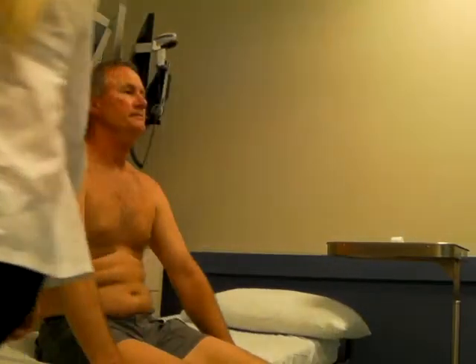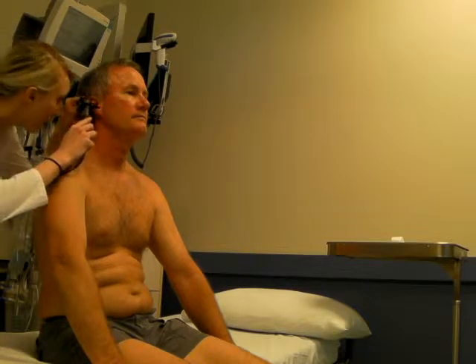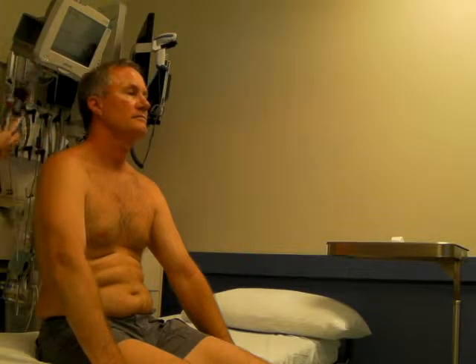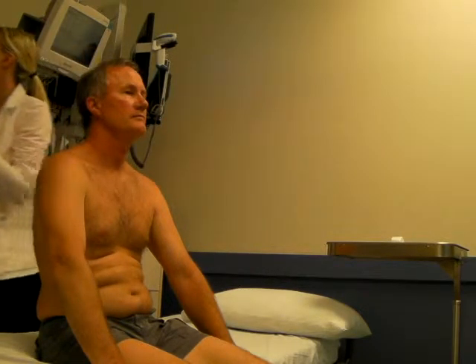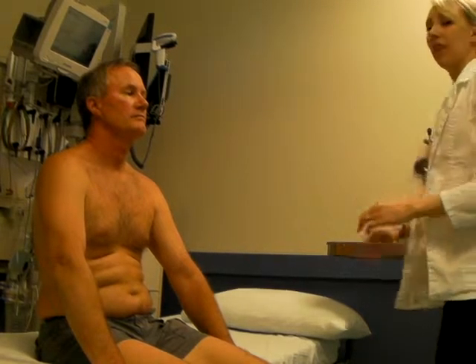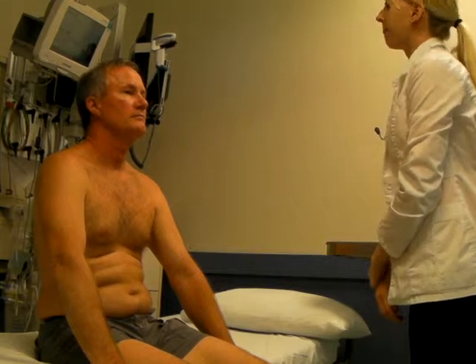Then I am going to visualize the tympanic membrane with the otoscope, noting that it is pearly gray and that the internal structures are visible. At this time, I'm also inspecting the ear canal, noting any redness or cerumen present.